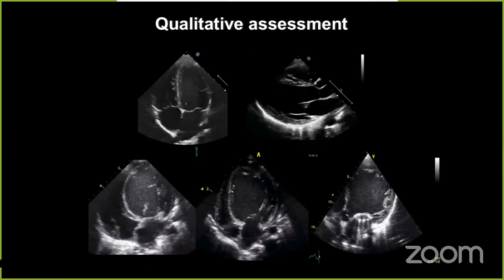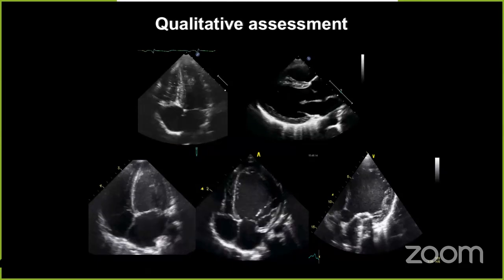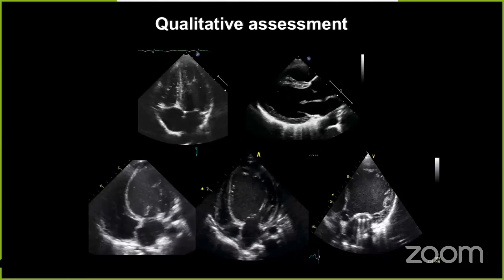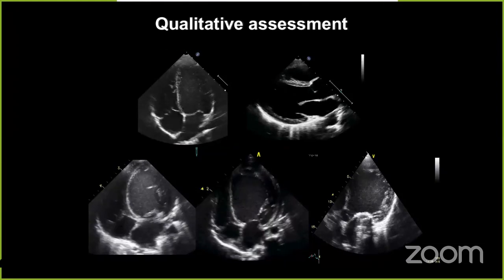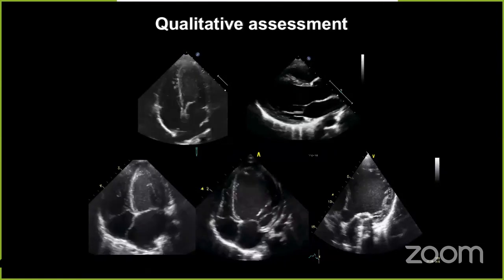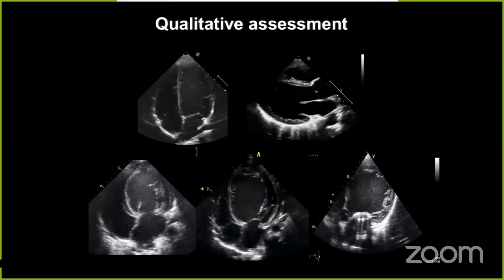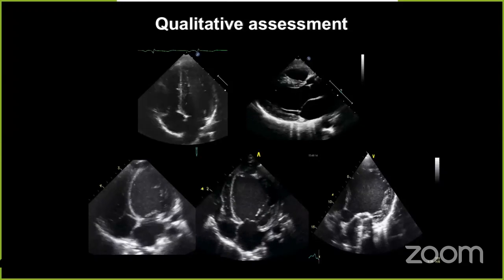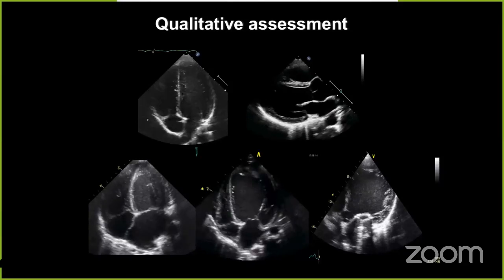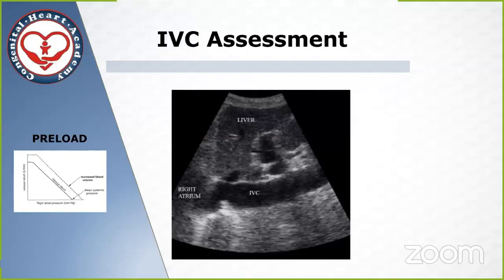With a quick eyeballing, we have to assess what we have in front of our eyes. It's not about quantity. It's not quantification. What we need is visualization and experience. With a rapid eyeball to the heart, we should take a look, we should know what is going on and how to intervene.